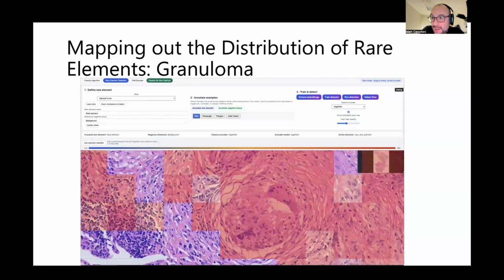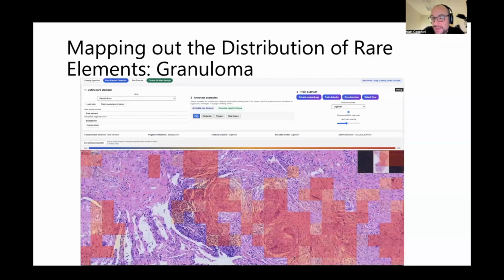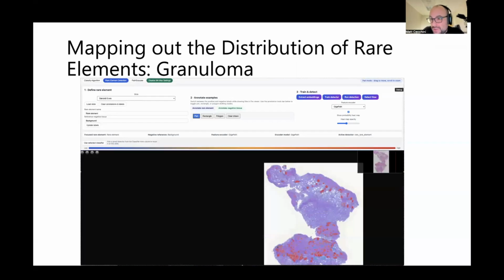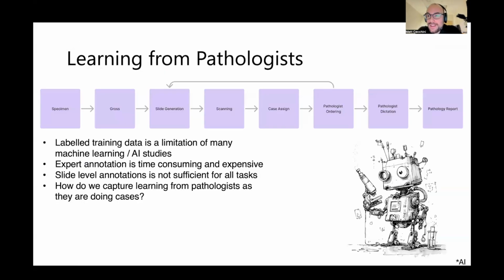And this can be really helpful for trainees who are looking at the case, right? To explain to them what a lymphangitic distribution of granulomas is, falling along the bronchovascular bundles and in a subpleural location, which you can see beautifully at this low power image once you highlight them. You wouldn't really be able to see that if you had to zoom into higher power. You lose it, right? This just opens up new ways in which we can look at these things.